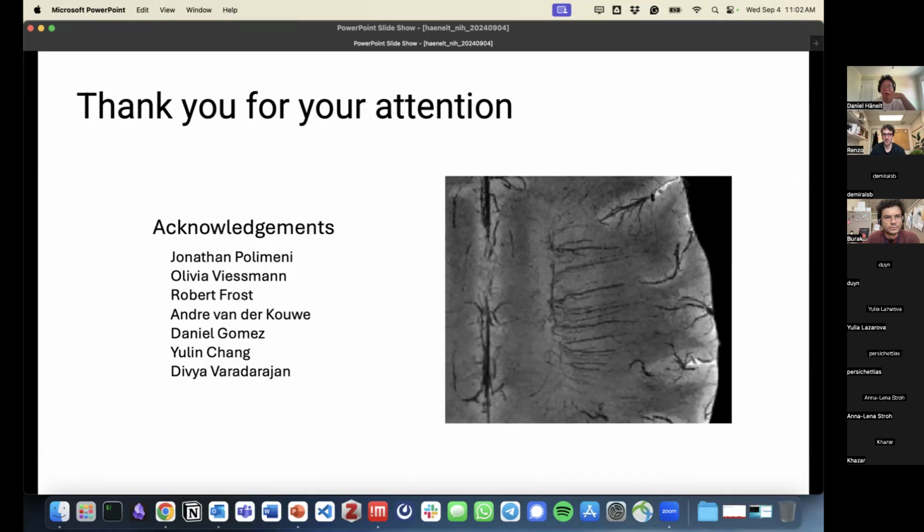So ultimately, to use the navigators, you're using a kind of volumetric alignment, get those coordinates, and then put them back into the sequence. Depending on how you estimate the volumetric alignment, it would be straightforward to use a mask that cuts out this slab artifact to begin with, right? For example, when I think about retrospective motion correction in SPM or ANTS or AFNI, I can always use a mask where I'm optimizing my motion estimation.